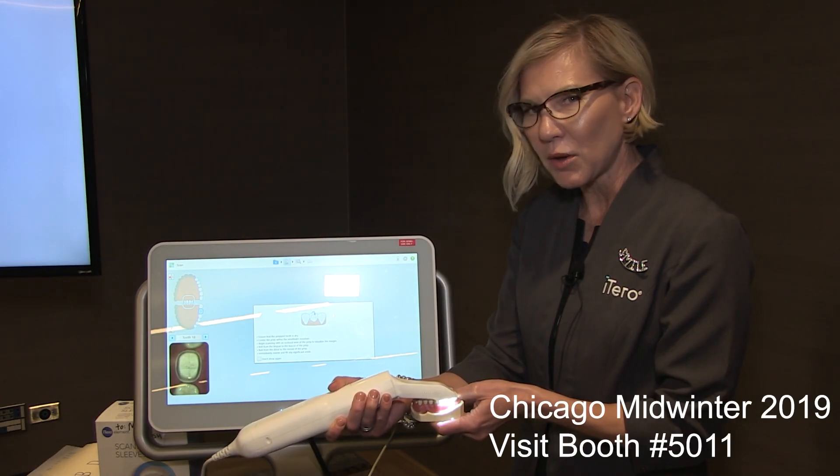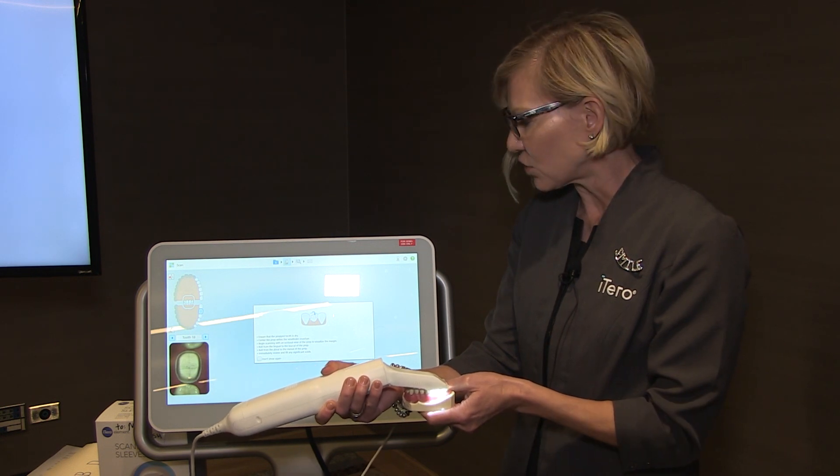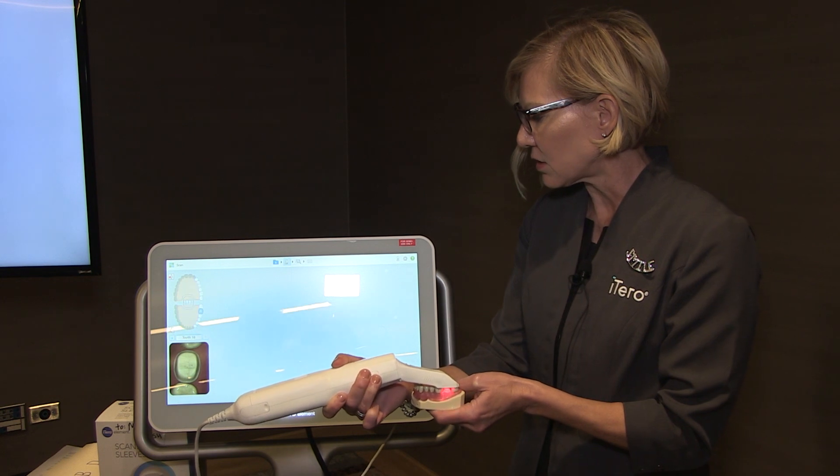Now we want to scan that prep in five to seven seconds. It should be a very efficient scan. I'm going to touch and release on the side button. Start scanning.